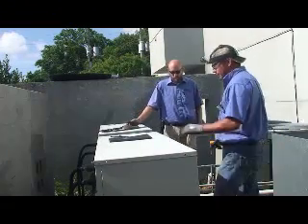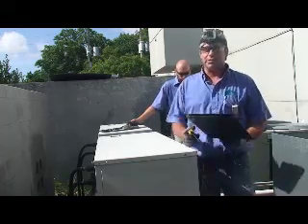First of all, I usually start by just taking all the screws out of the units.